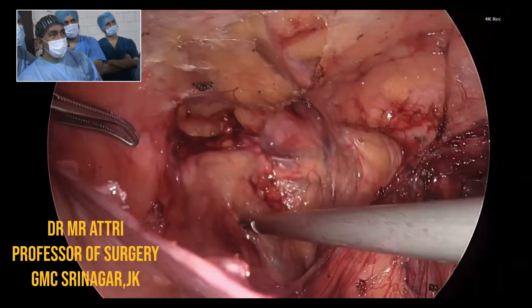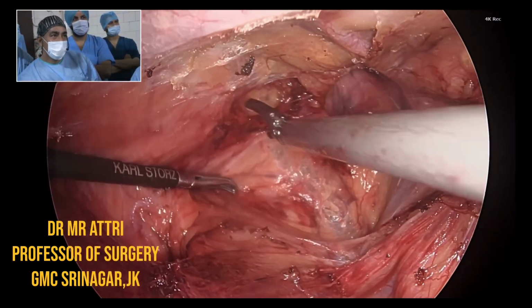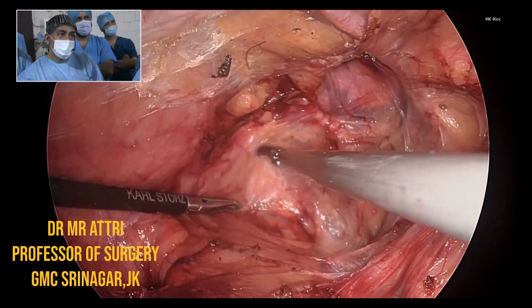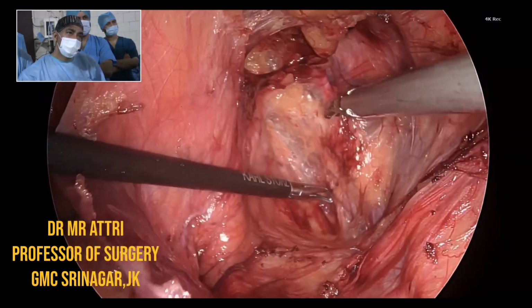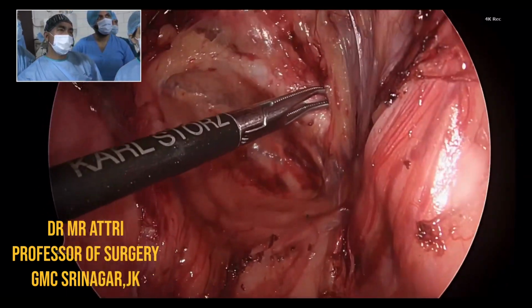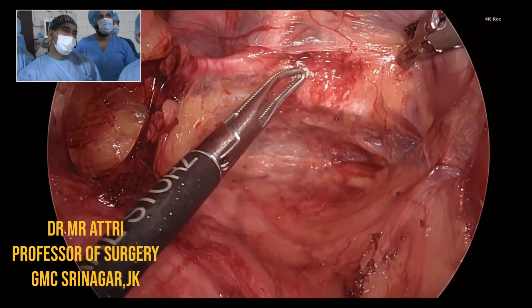Thank you so much, sir, for nurturing me, but many things are pending. Since this is a fascial surgery, planar surgery, we have to go 2 centimeters below the, this is the pubic ramus, right? This is the Cooper's ligament. Are we getting the lighthouse sign, sir? This is the lighthouse. My cameraman, show the lighthouse, please. So this is the right-sided Cooper's ligament.